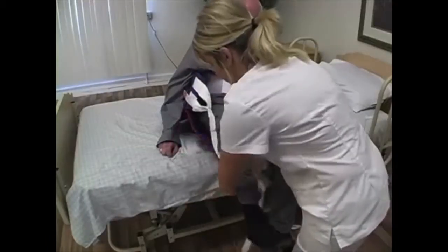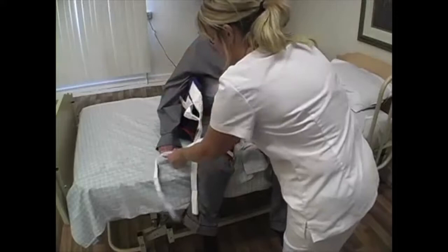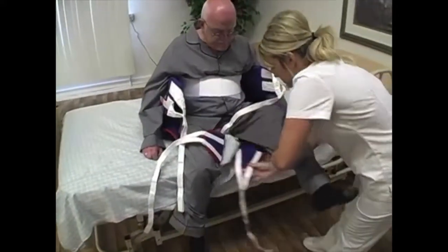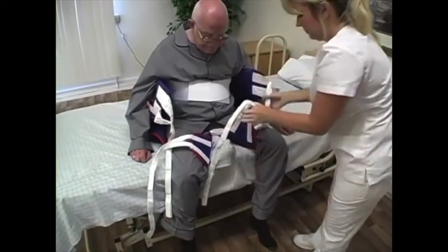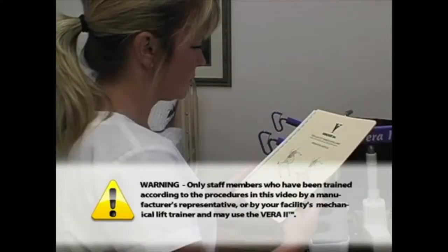The video is divided into different modules. Practice the procedures demonstrated in each module with staff members until you are comfortable and confident with your ability to operate the Vera 2 safely, before using it to transfer clients. WARNING: Only staff members who have been trained according to the procedures in this video by a manufacturer's representative or by your facility's mechanical lift trainer may use the Vera 2.